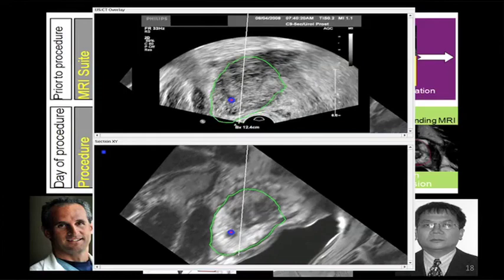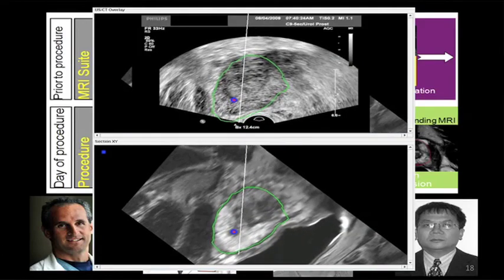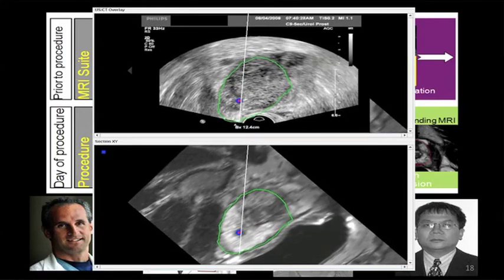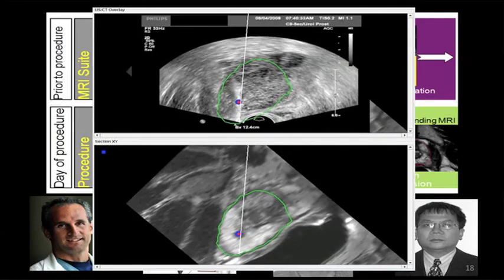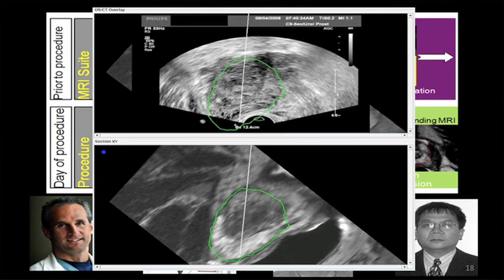And here is a small lesion, and this is the needle guide. And you can also move the pre-obtained MRI at the same time, and then just a small lesion is sampled accurately by this system. And here you can see the needle. So this is our biopsy approach. The medical GPS system, which fuses MRI to ultrasound on a rigid volumetric registration basis.